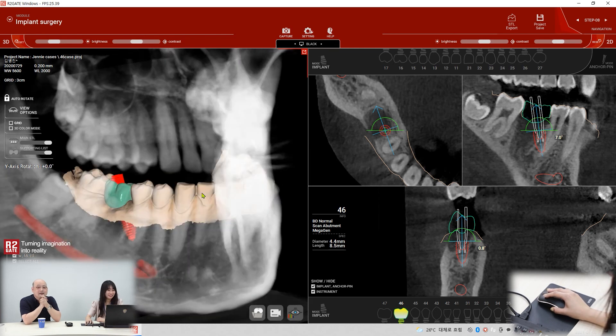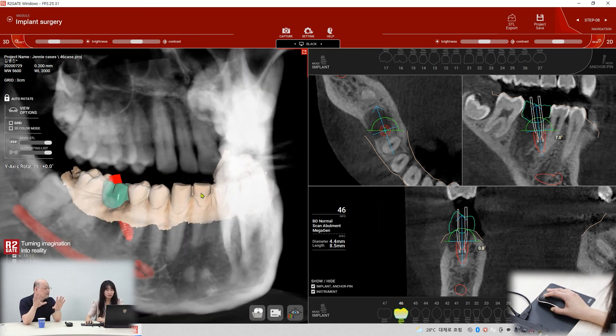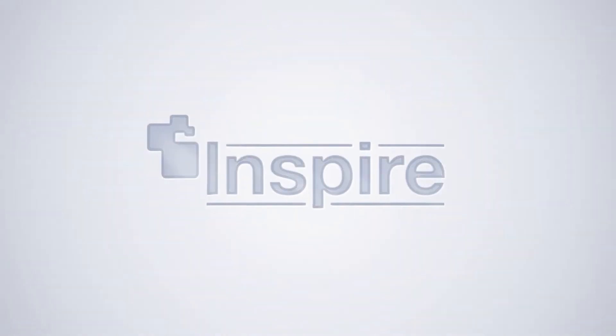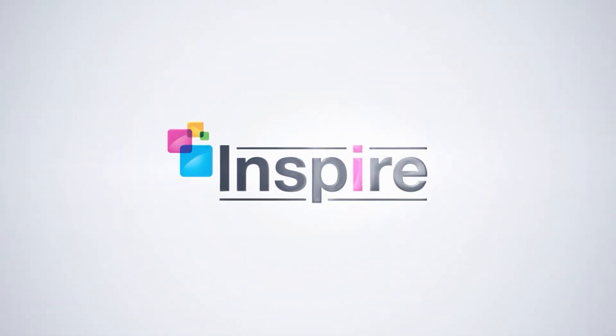And you just control the implant positions now. Okay, let's go through. I'm ready.